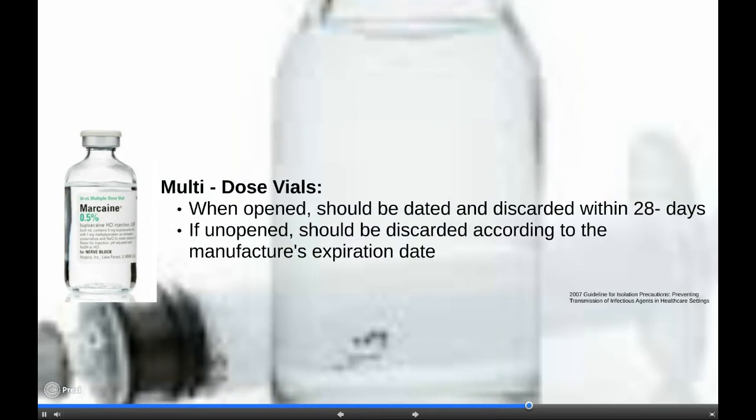Open multi-dose vials should be dated and discarded within 28 days, unless the manufacturer specifies a different discard date for an open vial. Unopened multi-dose vials should be discarded according to the manufacturer's expiration date.